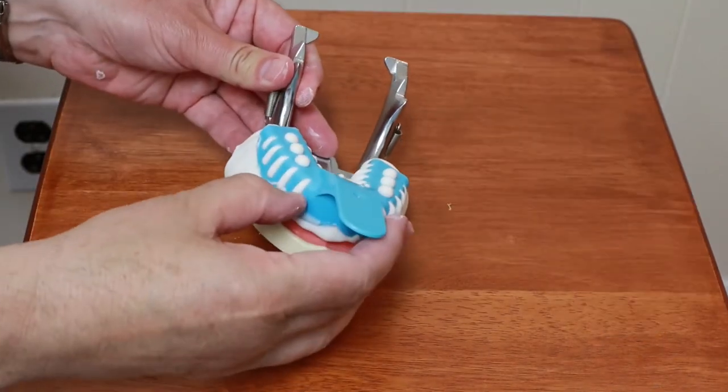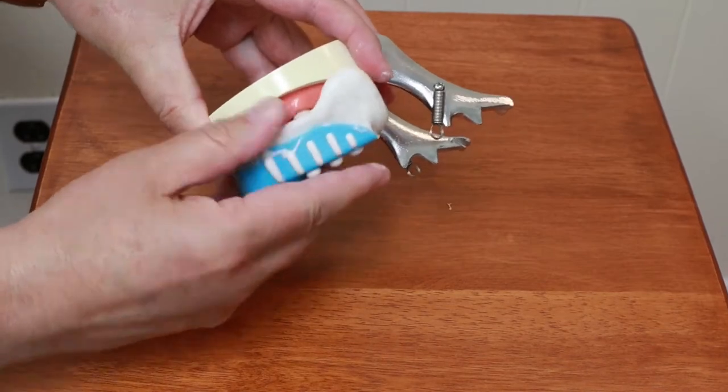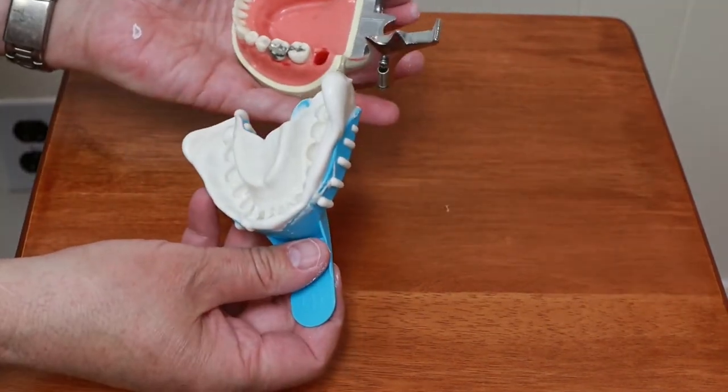The material is set up now. Just separate, take the impression out. And there we have the impression of the lower teeth.